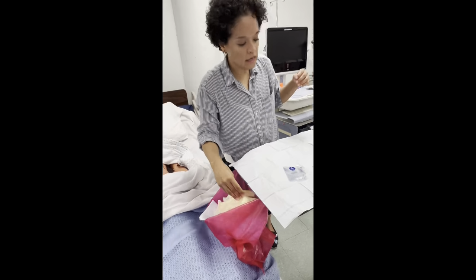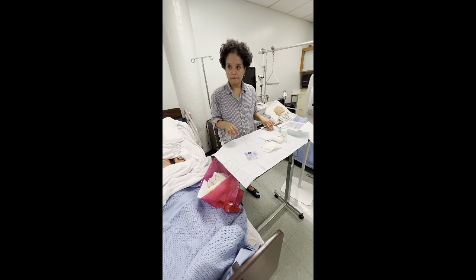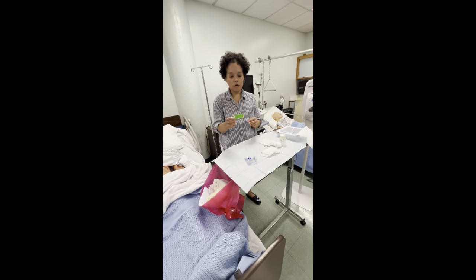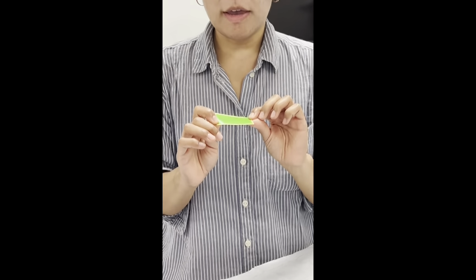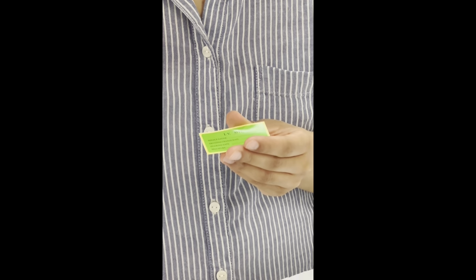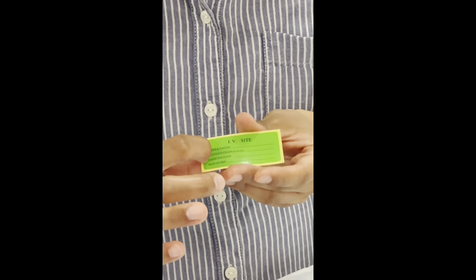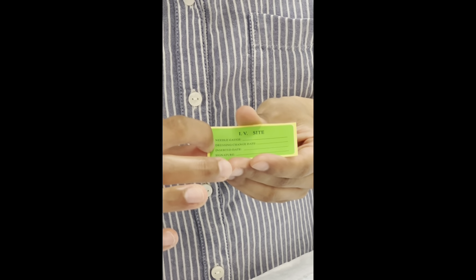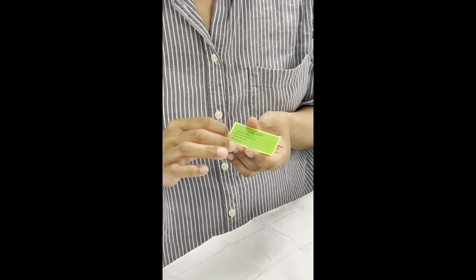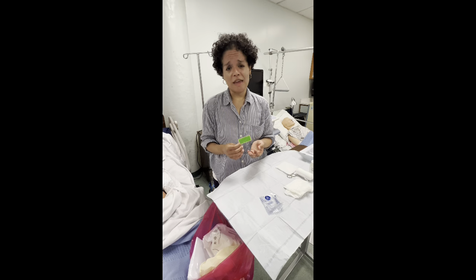We're going to clean the area. And make sure that as you are cleaning up, you apply your label. So you want to make sure that you include your name and your credentials. You want to include the date and the time that you performed the dressing change and what kind of dressing was performed. So in this case, we performed a dry sterile dressing. You could just simply put DSD.